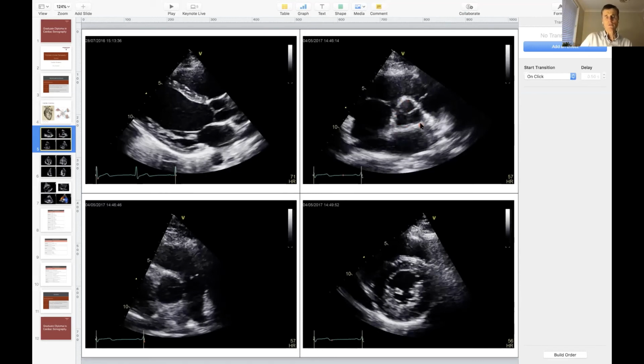So if we are looking from this parasternal short axis view, at the top of the image here, near the right ventricle, we see the right coronary cusp. Down here in this bottom third, what we can see is the left coronary cusp. And over here, the non-coronary cusp. Again, of course, these cusps are named according to the coronary artery just superior to them. So just superior to this cusp will be the coronary sinus that leads to the right coronary artery.